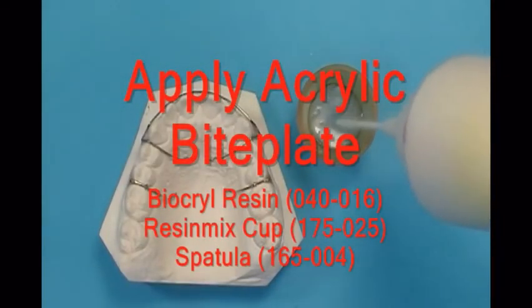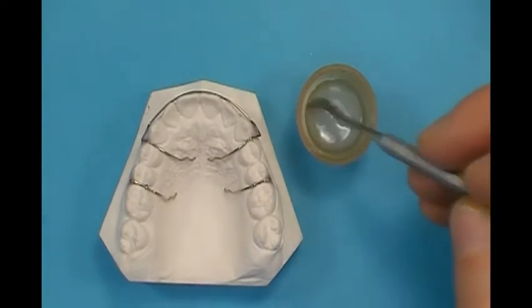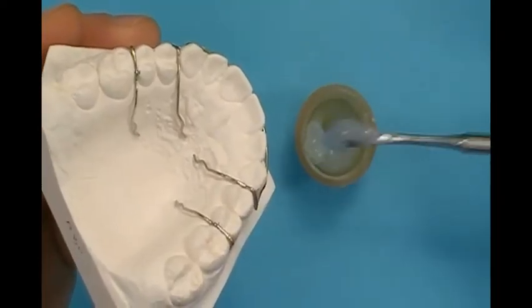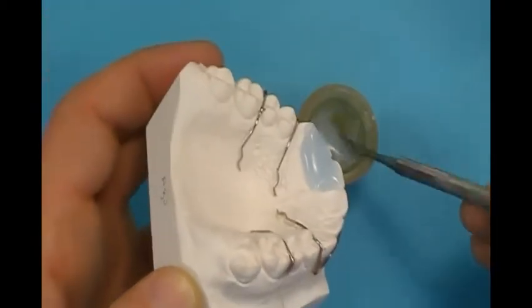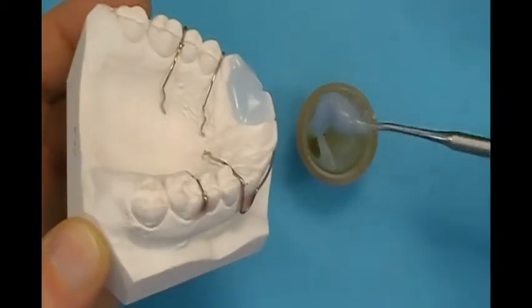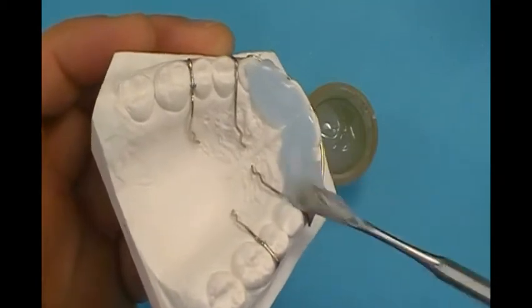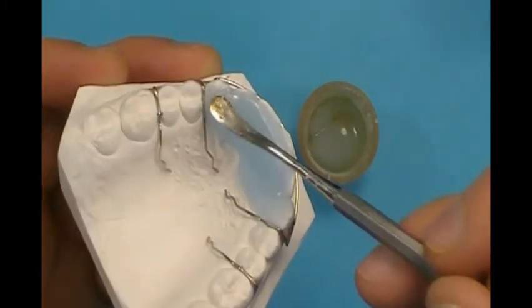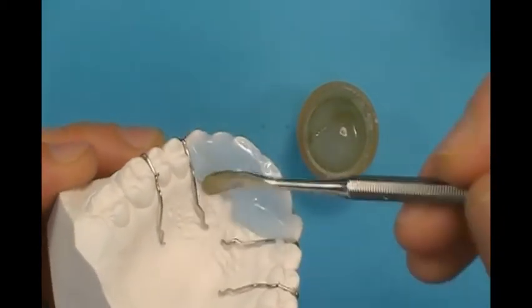Mix BioCro resin to a thick maple syrup consistency. Build an acrylic ledge lingual to the anterior teeth with resin. Adjust height to the prescribed level, making sure the applied acrylic will occlude against opposing teeth.